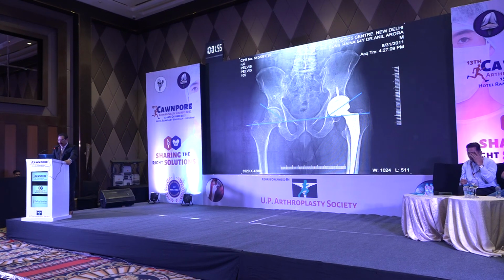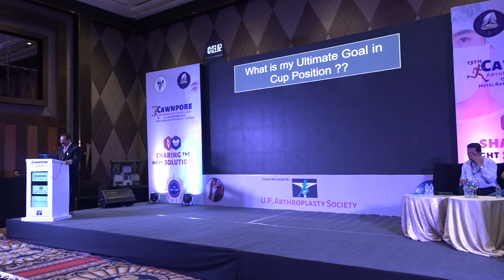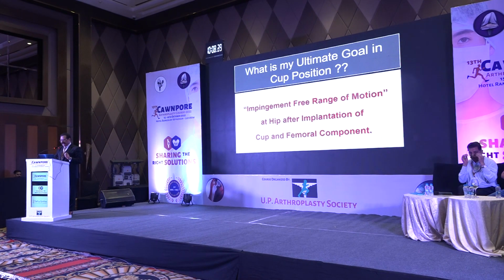So what is my ultimate goal in cup position? What I want is impingement-free range of motion at the hip after implantation of the cup and femoral component. That is the safe zone.